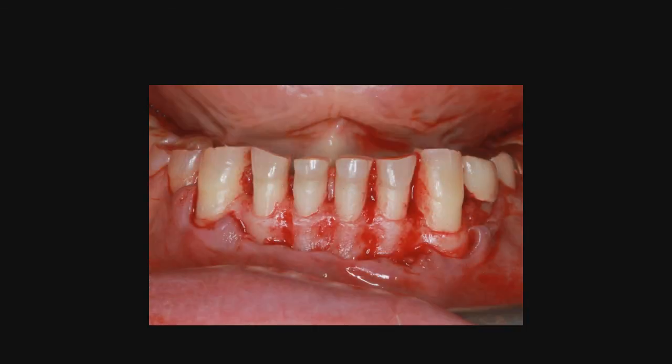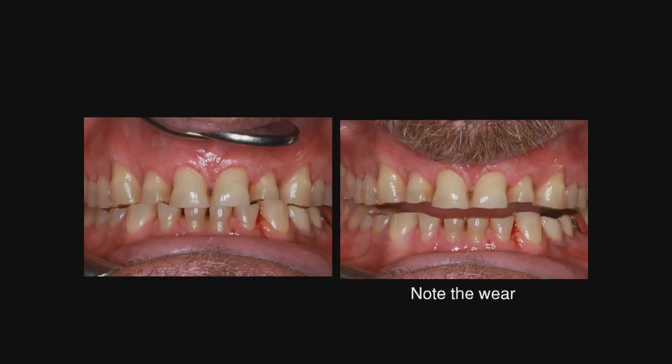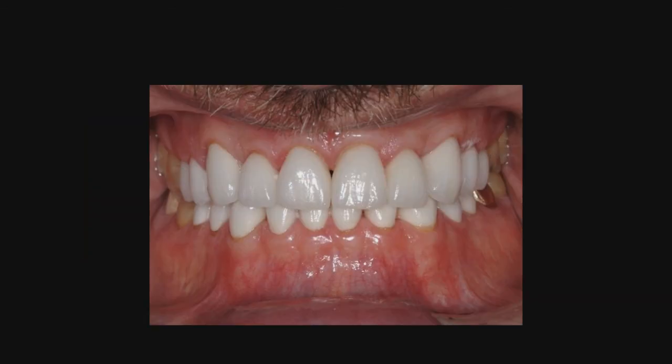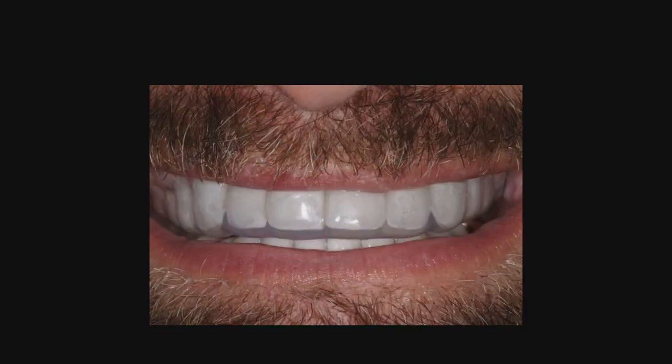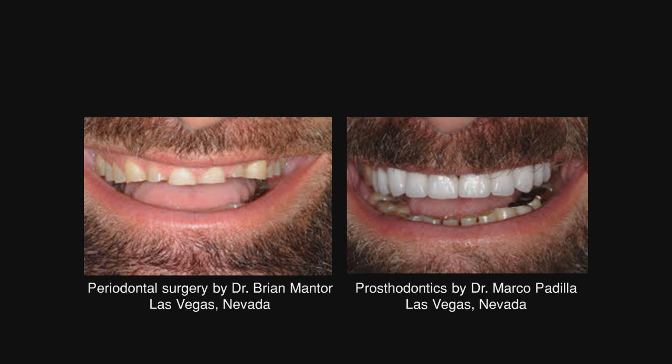And the lower we see here, and now the areas are sutured together, and post-operatively on the left we can see the patient is now ready to have the restorative done, but note the wear. Here is the final post-op, one of the nicest cases I've seen in a long time, and you will notice the night guard that was placed here. Obviously, with that amount of wear, you're certainly going to want to have a night guard made. This is where he started, this is where he ended up, and Brian Mantor, you did a great job, as well as the prosthodontist, Dr. Marco Padilla.